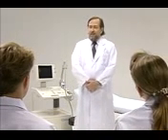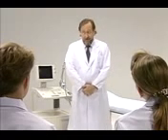We must analyze the ultrasound information to identify abnormalities. To do this, we must faithfully follow the given procedures based on anatomical knowledge. Otherwise, we cannot identify lesions. Let's discuss how to proceed with an ultrasound examination in clinical practice.